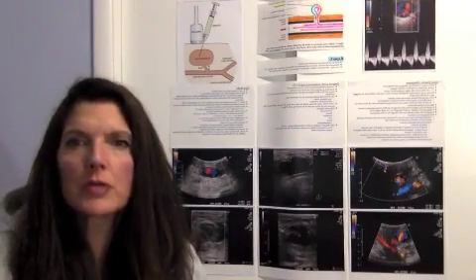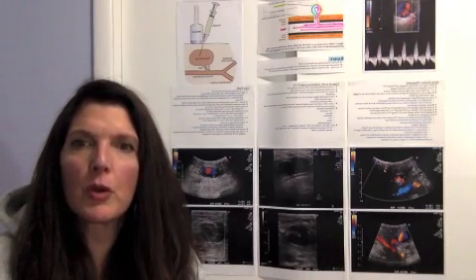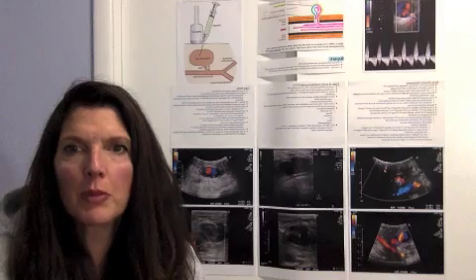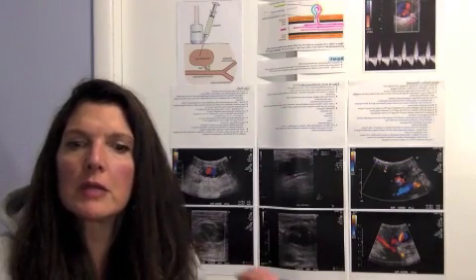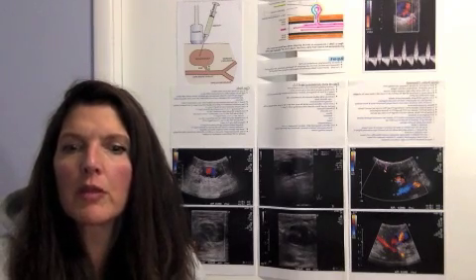In cases where the ultrasound guided compression of the pseudoaneurysm is unsuccessful, the treatment of choice is ultrasound guided thrombin injection. In this procedure, you want to first identify the pseudoaneurysm using spectral and color Doppler to find the blood flow patterns. Then once it's been identified, you want to turn off the color and spectral and visualize the pseudoaneurysm using B mode so that you can see the needle and be able to guide the needle into the lumen where it is injected with the thrombin.